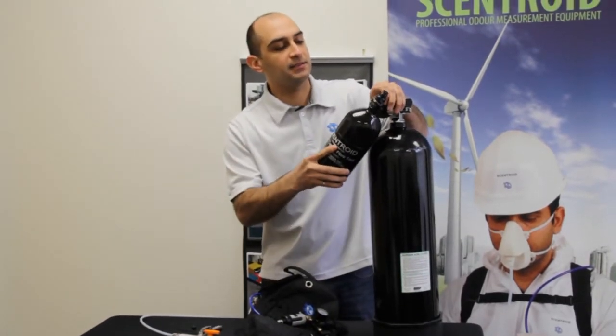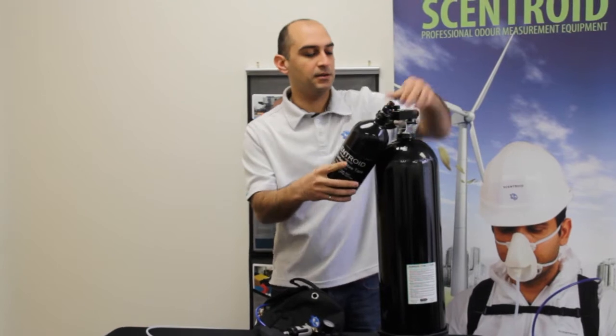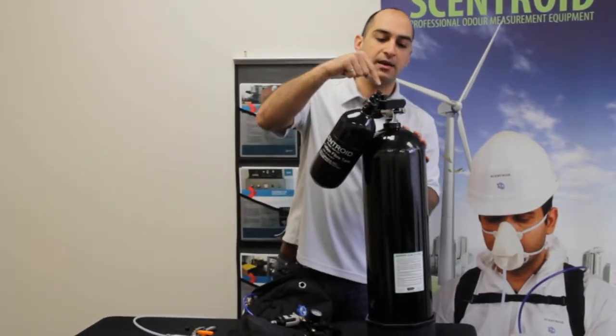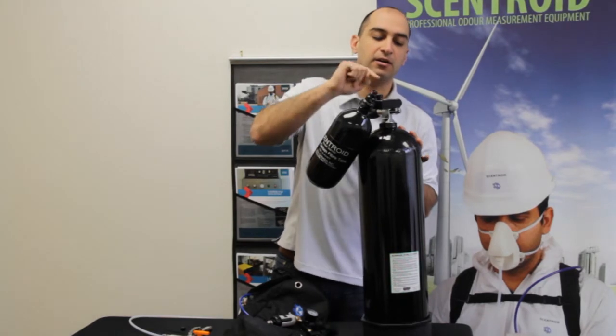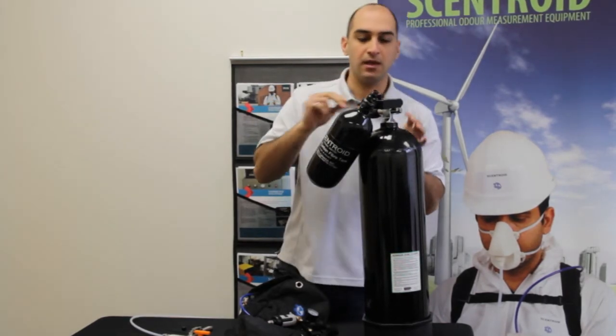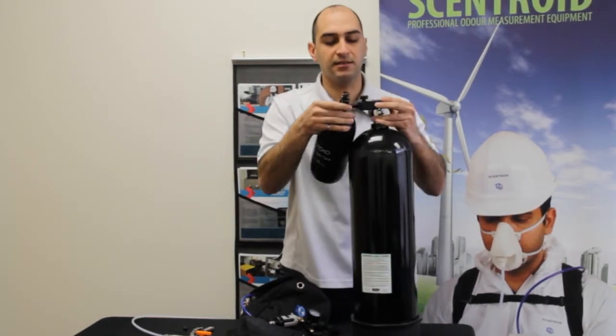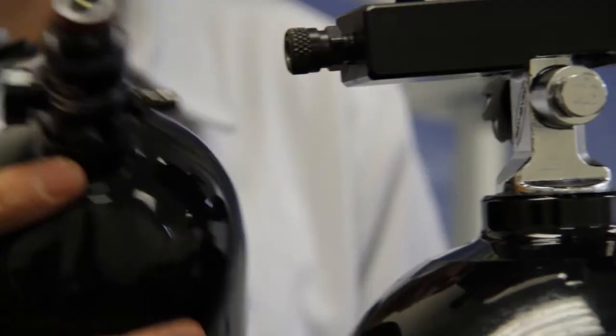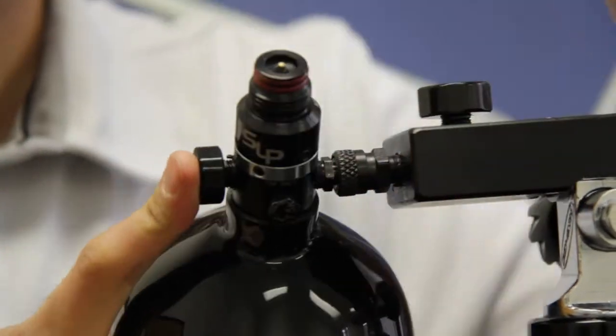Connect it to our adapter. This is a standard scuba tank with a K valve, and it has here our fill station. I'm just going to attach it like that. You just pull back on the ring and push the nipple in.